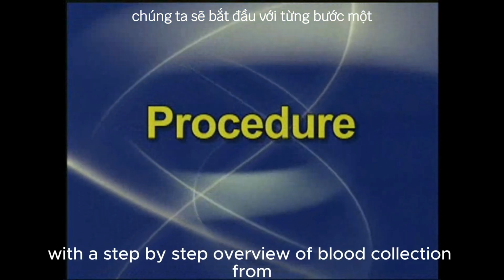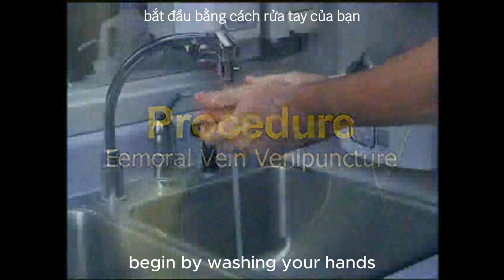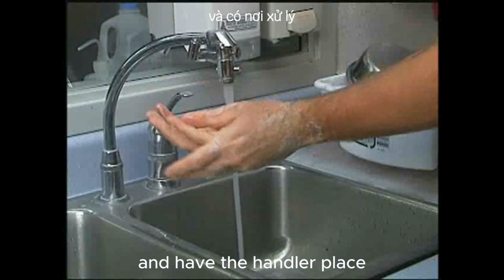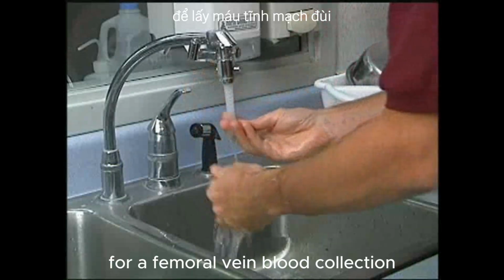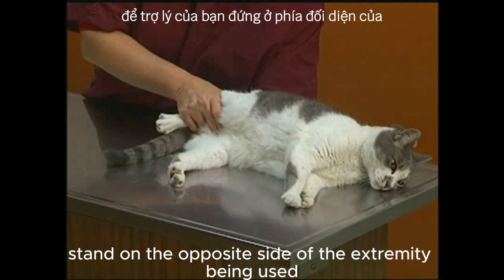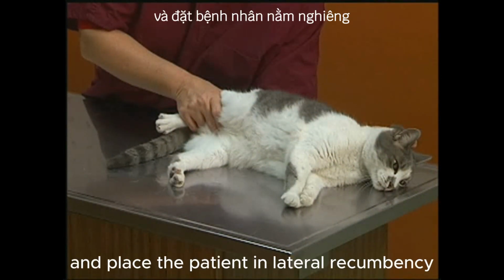We will begin with a step-by-step overview of blood collection from the femoral vein. Begin by washing your hands and have the handler place the patient on the exam table. For a femoral vein blood collection, have your assistant stand on the opposite side of the extremity being used and place the patient in lateral recumbency.